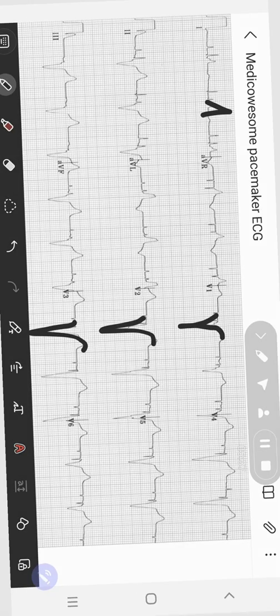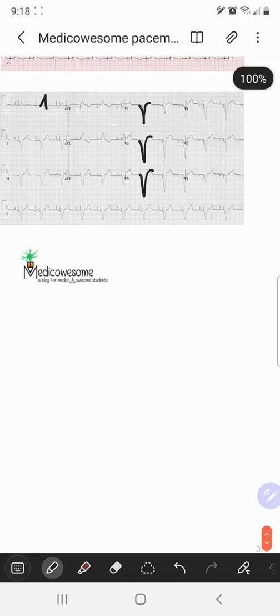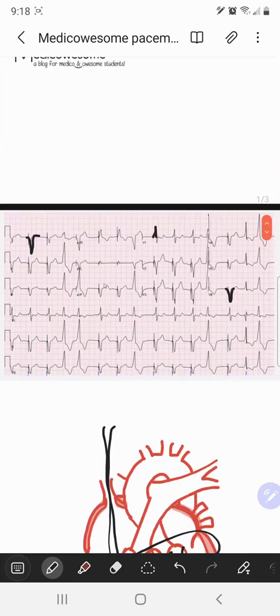What about this second EKG? If you are thinking standard RV pacing, then you are again right. It is demonstrating a left bundle branch morphology in most leads. In this particular EKG, you can also see the R wave in lead I, though you don't see it in V6. Hopefully this video is helpful and stay awesome.